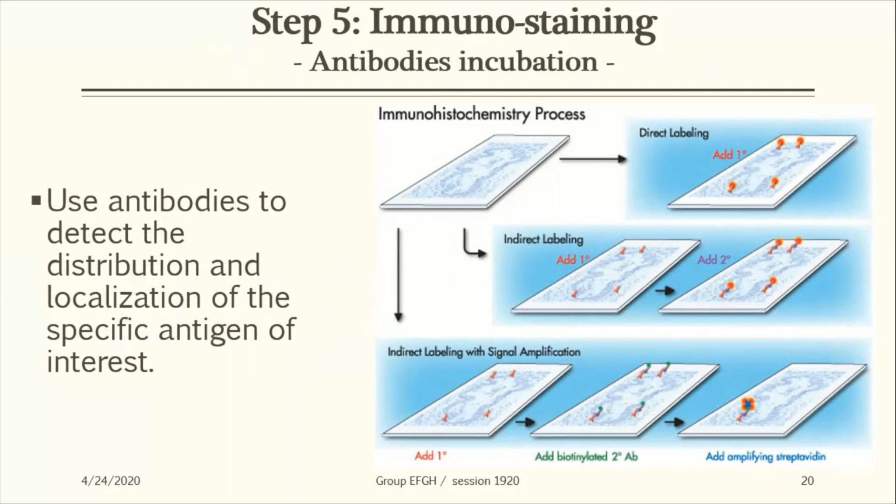Hence, clinical information of the antigen, the function, the subcellular localization, and expression profile helps in determining the antibody selection. The incubation period may vary for different primary antibodies.